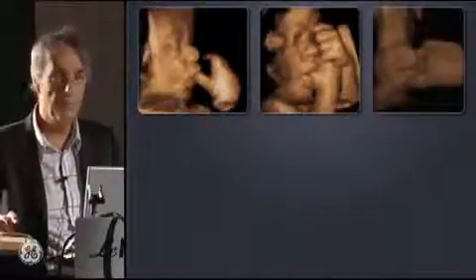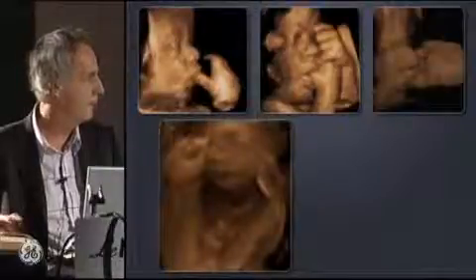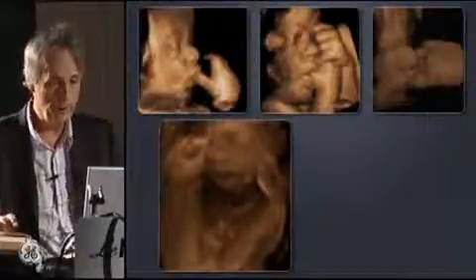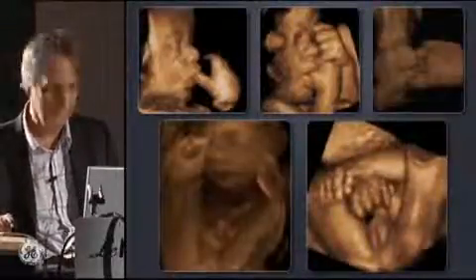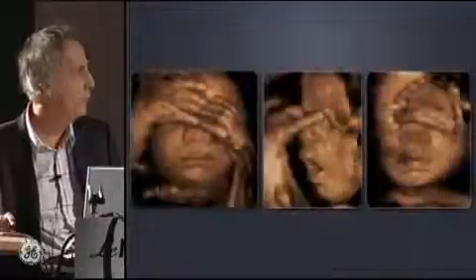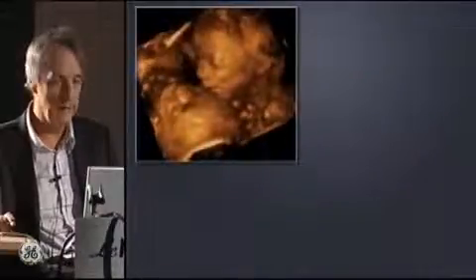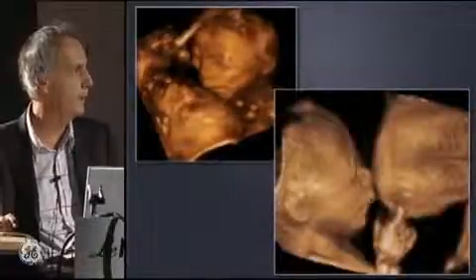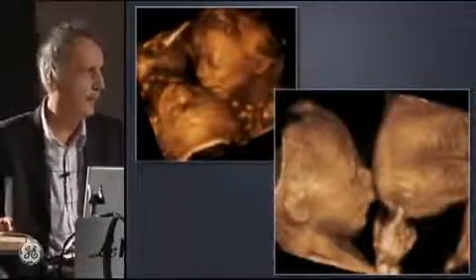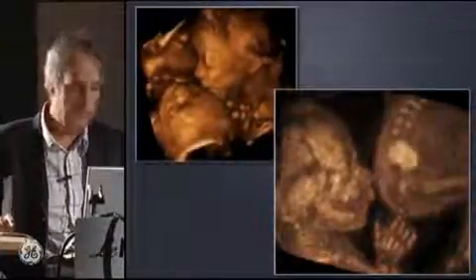but this one is sucking his big toes, and this one is looking at his penis here with open mouth, I don't know why, and this one is a real boy. This fetus don't want to see what's happened. The kiss, cute, nice. But look at these twins. This one is smelling the bottom of the other one. And you can switch to the maximum mode, and with the maximum mode you can see inside.